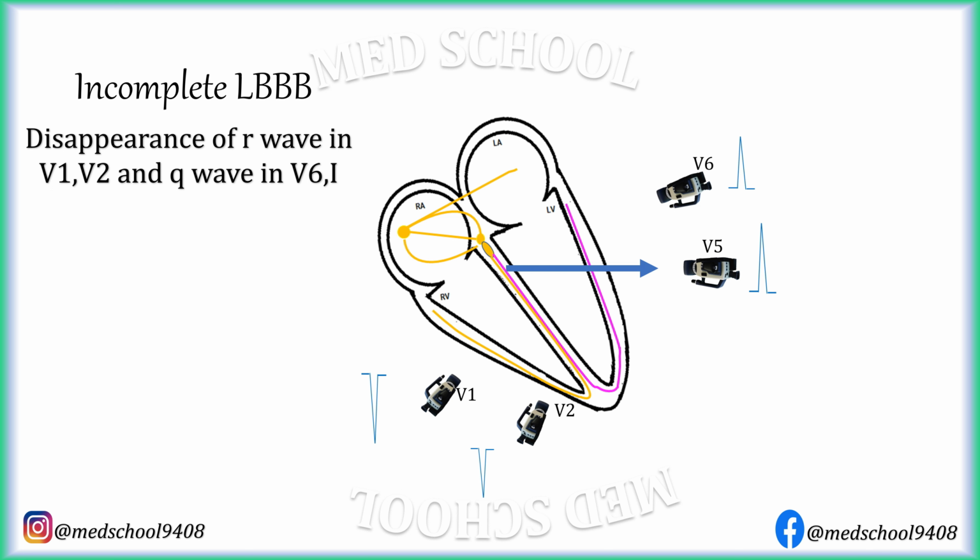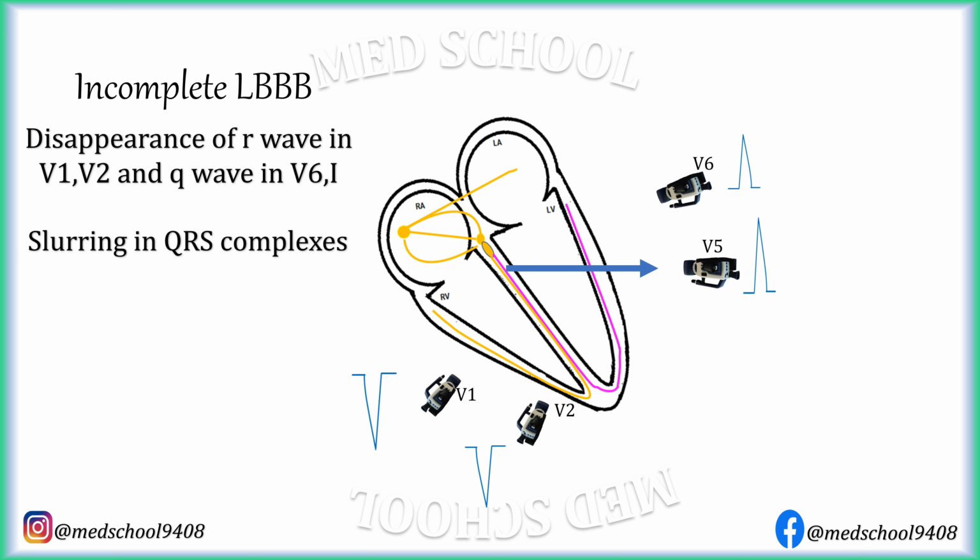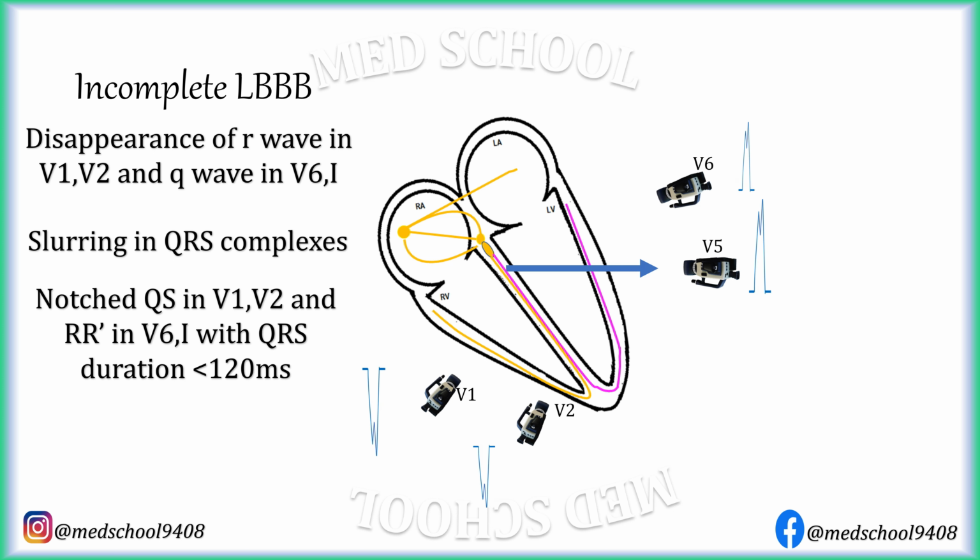As severity of LBBB increases, QRS complexes become slurred and ultimately notching may appear. QRS duration remains less than 120 milliseconds, which is differentiating factor between complete and incomplete LBBB.